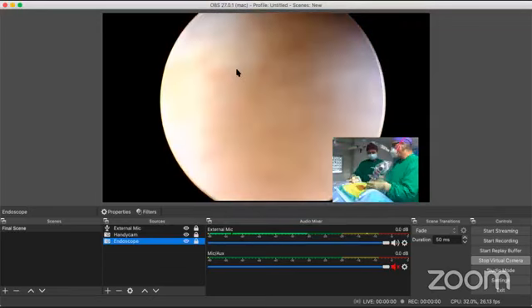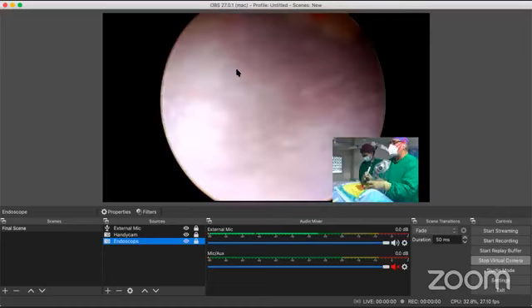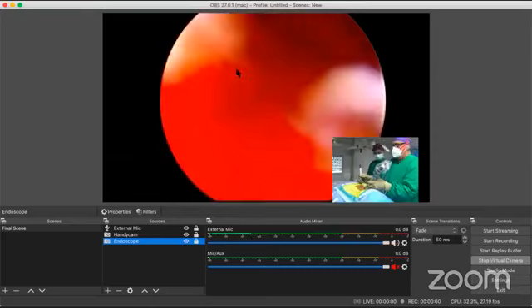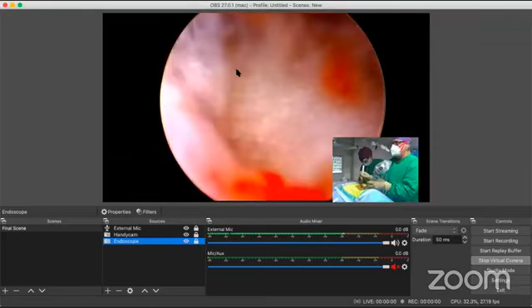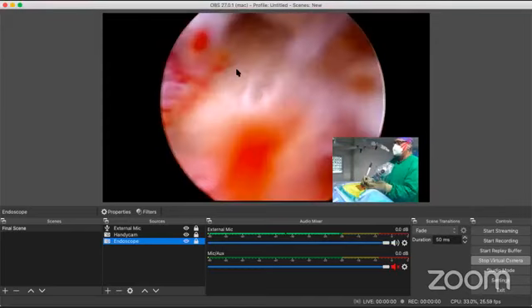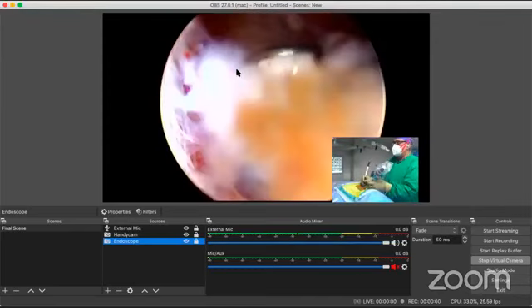But before I proceed, before I fire, now I want my machine. I want to be comfortable. Two things you have to remember in the cervical spine. Do not fire until you see your tip, and do not fire if you're not on bone.